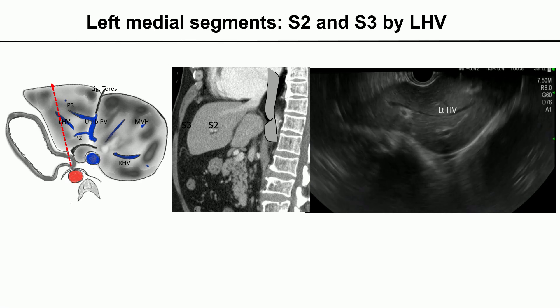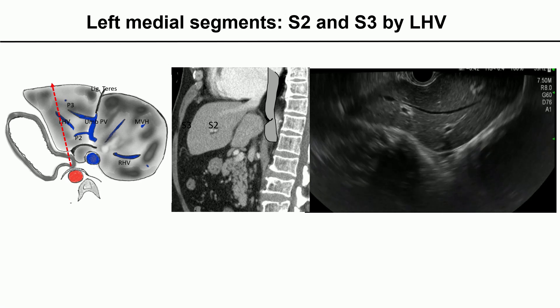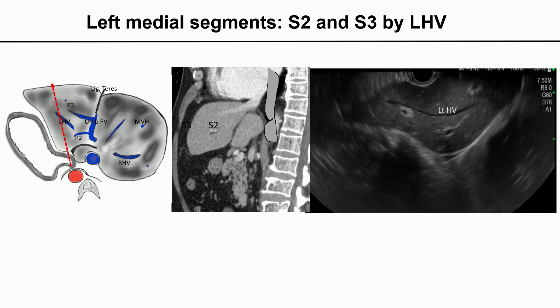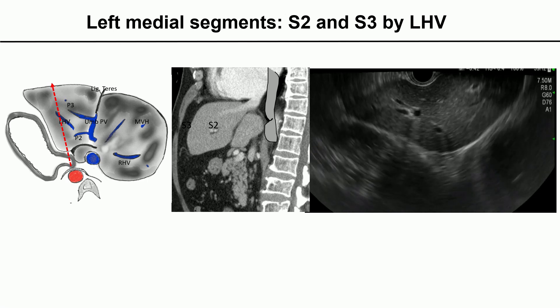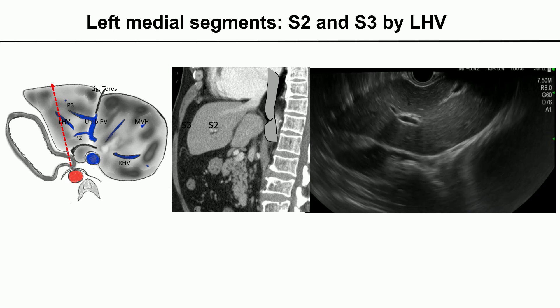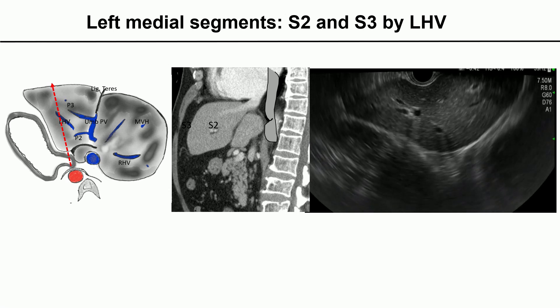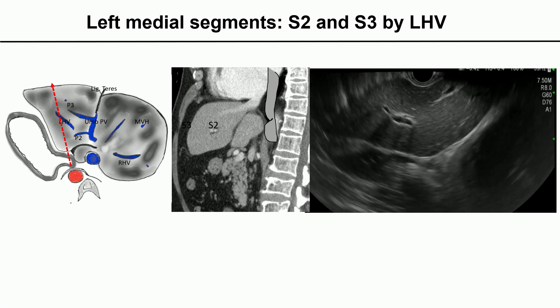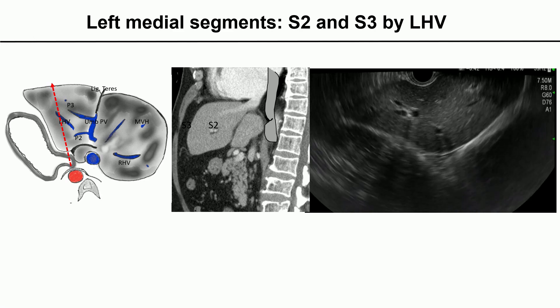From the stomach toward the left liver, S2 is close to the probe and S3 is farther away. The left hepatic vein separates S2 from S3. As shown in this video clip, the left hepatic vein separates S2 from S3, and we can see the P2 and P3 portal veins.